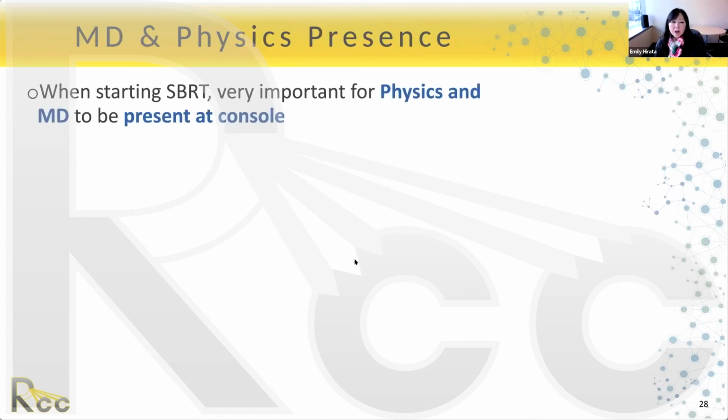Okay, some comments on physician and physics presence for SBRT treatments. When starting an SBRT program, it is really important for physics and the physician to be present at the console. This will reduce delays. You know how I mentioned that sometimes between imaging and determining your shifts, that can take a while because you're really trying to find perfect alignment, and it's really easy to just lose track of time, honestly, trying to do that. So having the physics and physician there at the console will actually reduce delays.